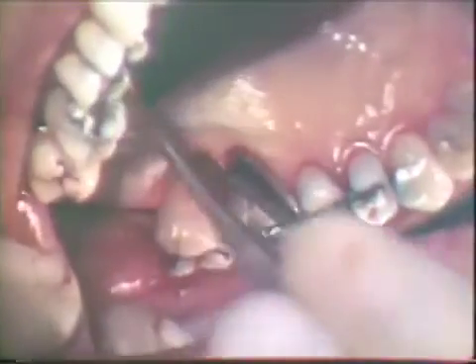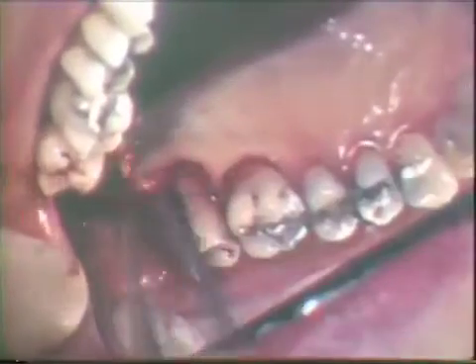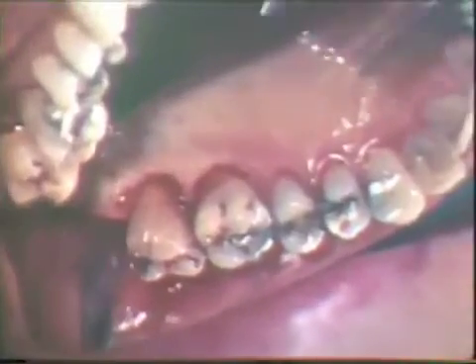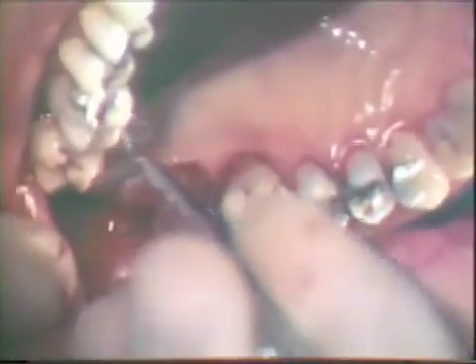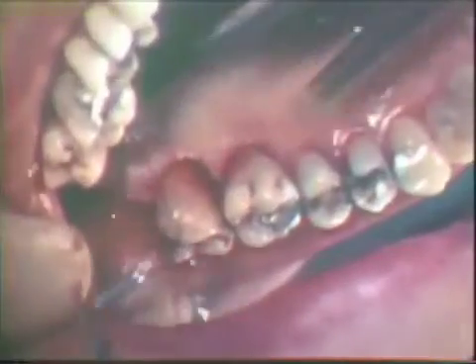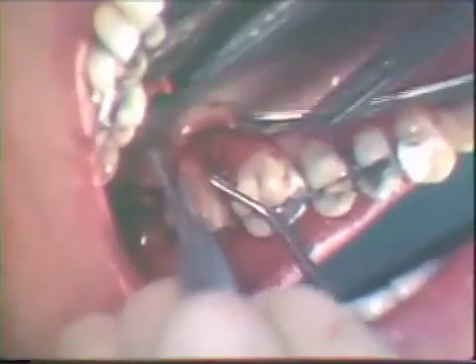The flap is raised with a buccal periosteal elevator. The palatal tissue that was separated from the flap by the previous incision adheres to the underlying bone when the flap is deflected. These adhering tissues are freed with an Orban knife. The incision is made around the neck of the teeth and on top of the bony surface.